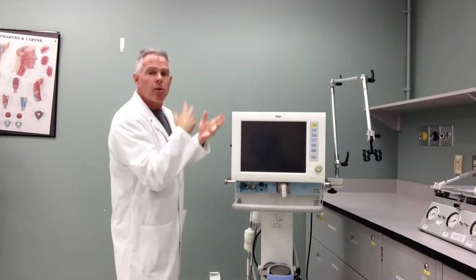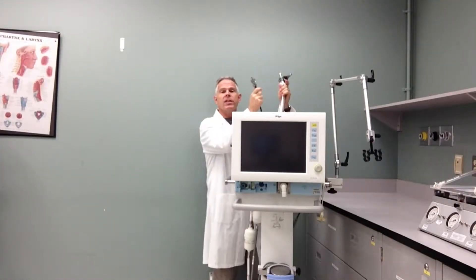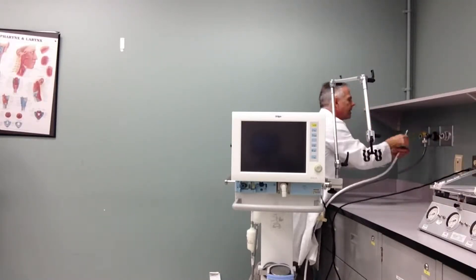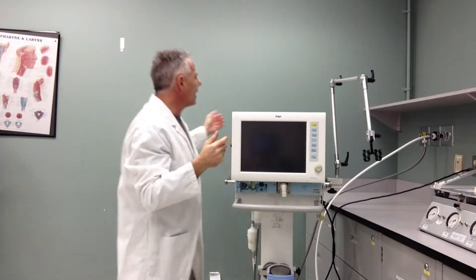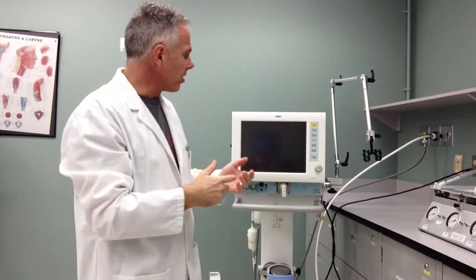One of the first things I do is get it ready by hooking up our electrical outlets and our gas outlets. You can just plug those in, get a gas source through there. I can actually even turn the ventilator on right now. So do a lot of these external things before you actually handle the circuit.